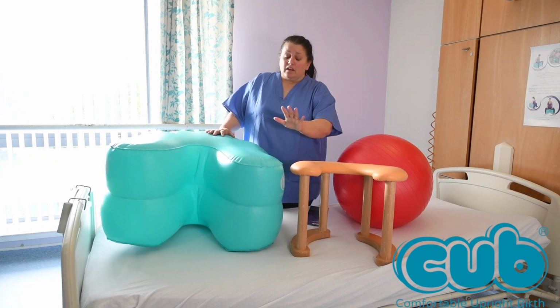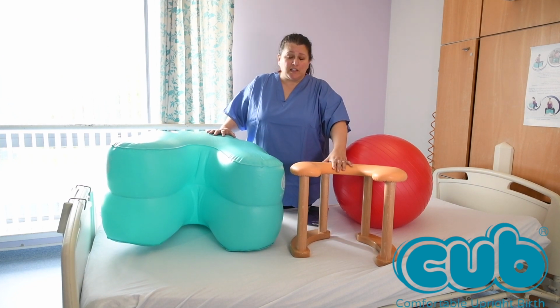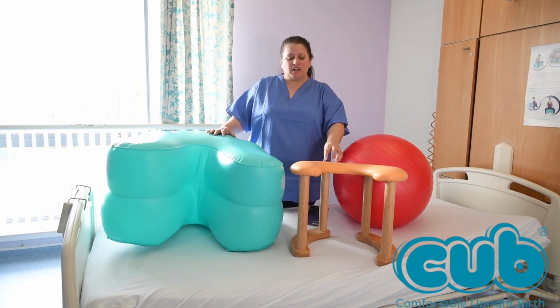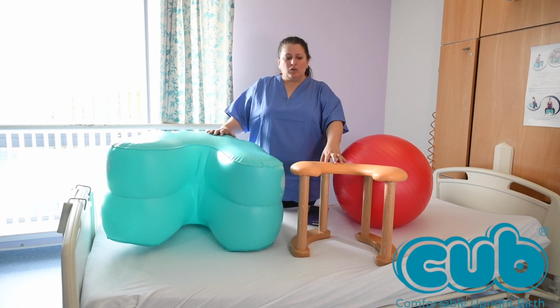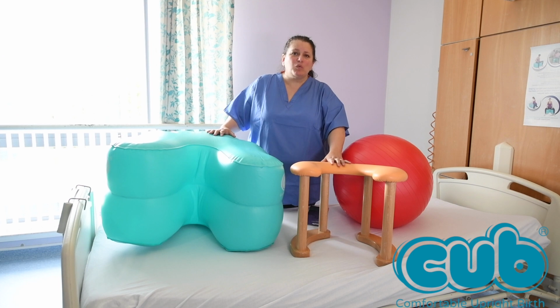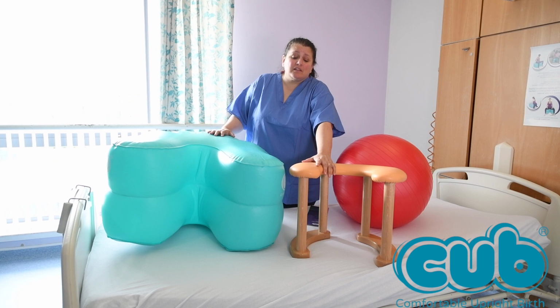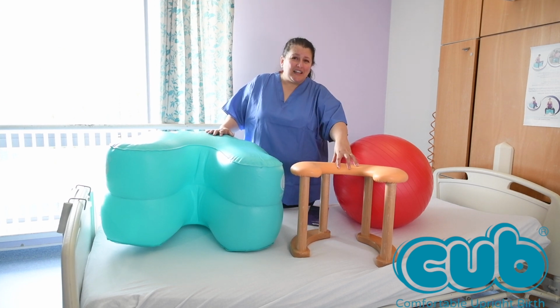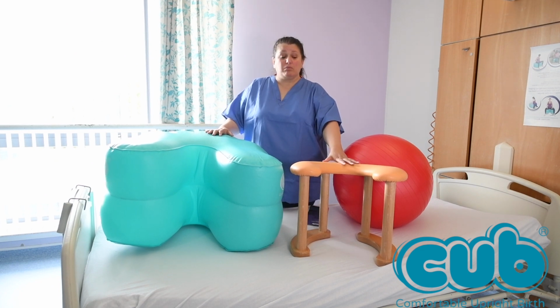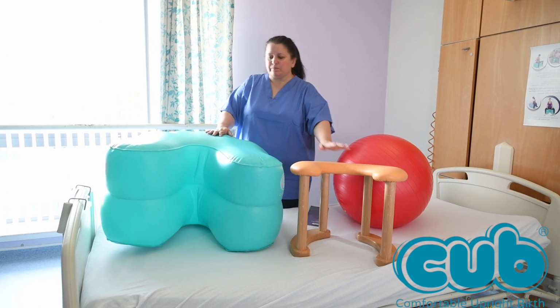Well, the main one is, on a birth stool, you can really only use it to sit on. I have seen photos online of people that sell rigid birth stools, with people in wholly optimistic positions that in the real world most people aren't going to use because they're quite uncomfortable, they're hard, they're not easy to use. So really they're designed for people to sit on. That's their main purpose, not for any other purpose, although some people do try and use them in other ways.